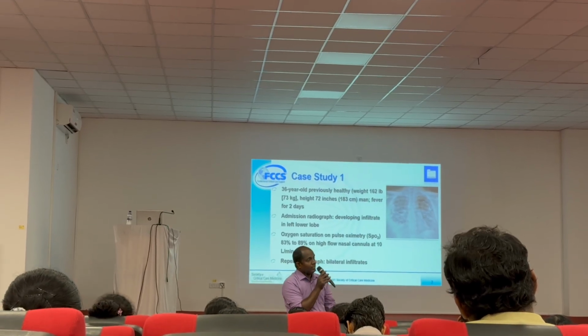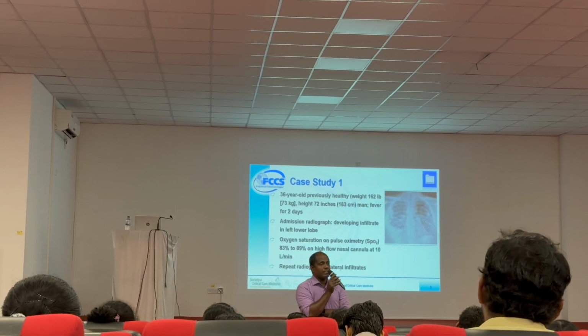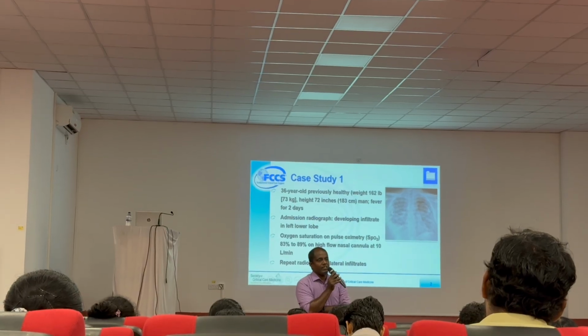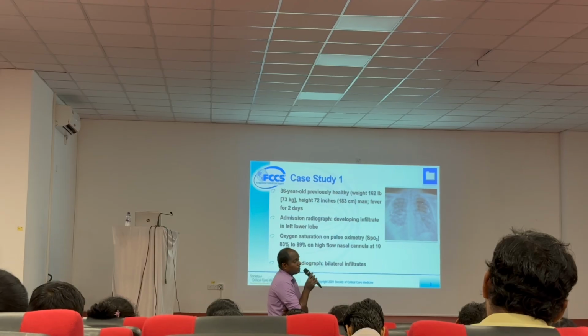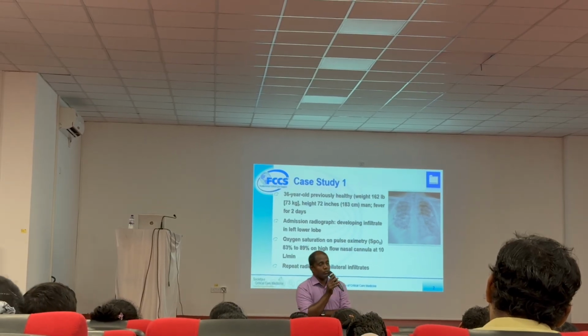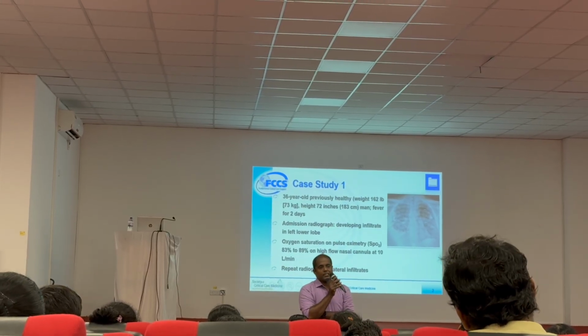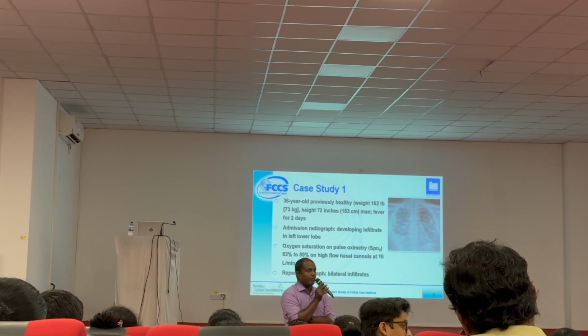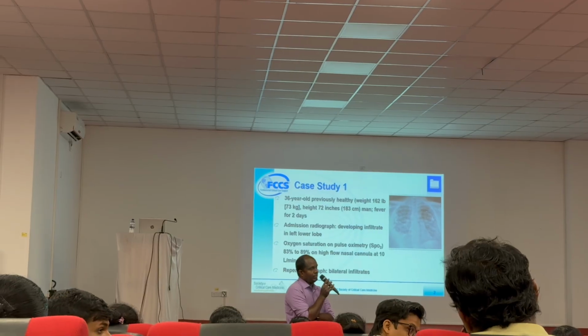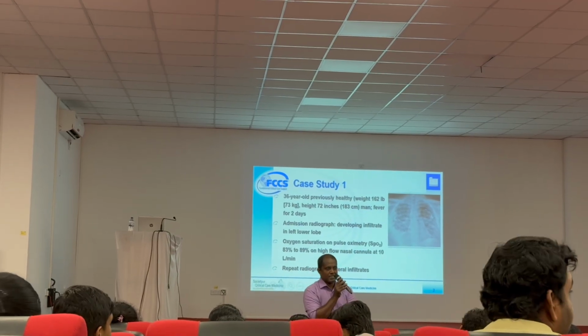Why does the patient need a ventilator? Someone is struggling to oxygenate in the case of pneumonia, or someone is struggling to ventilate, meaning they are not able to eliminate carbon dioxide or not able to do the minute ventilation.